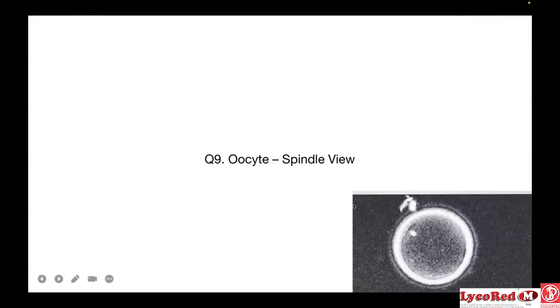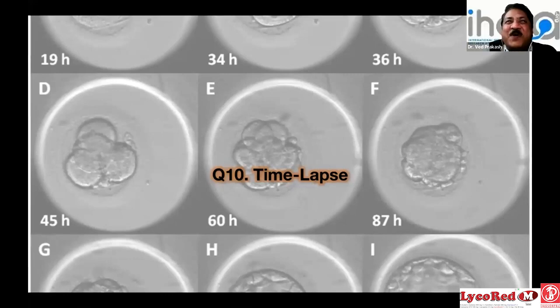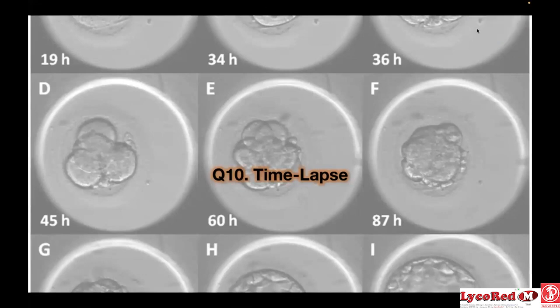So yeah, next is the much discussed topic, time lapse. I am not using it, but who is using? I'm Tarika. Yeah, Tarika. I have an embryoscope in my lab, and the result is very good. For blastocysts, I'm happy with this time lapse. Non-disturb culture system, I like this.